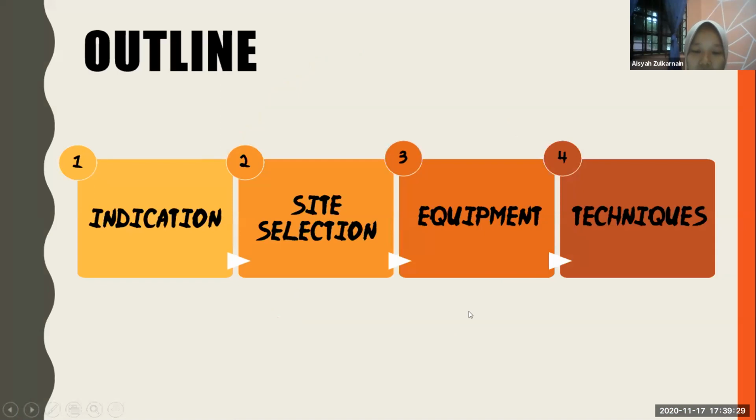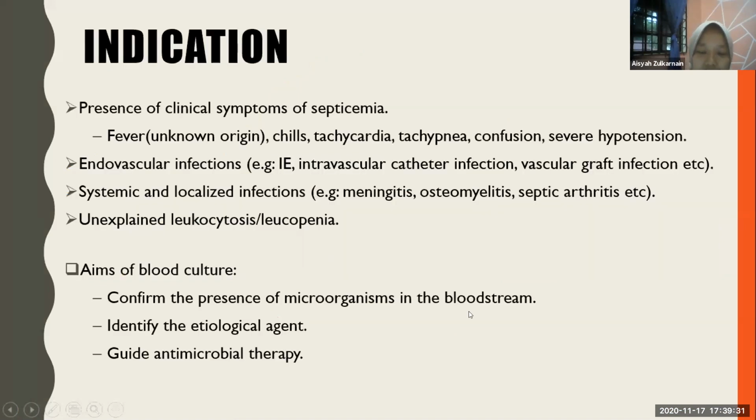So blood culture and sensitivity is a laboratory test in which the blood taken from the patient will be inoculated into a bottle which contains culture medium to determine the presence of microorganisms that are causing the infection to the patient.